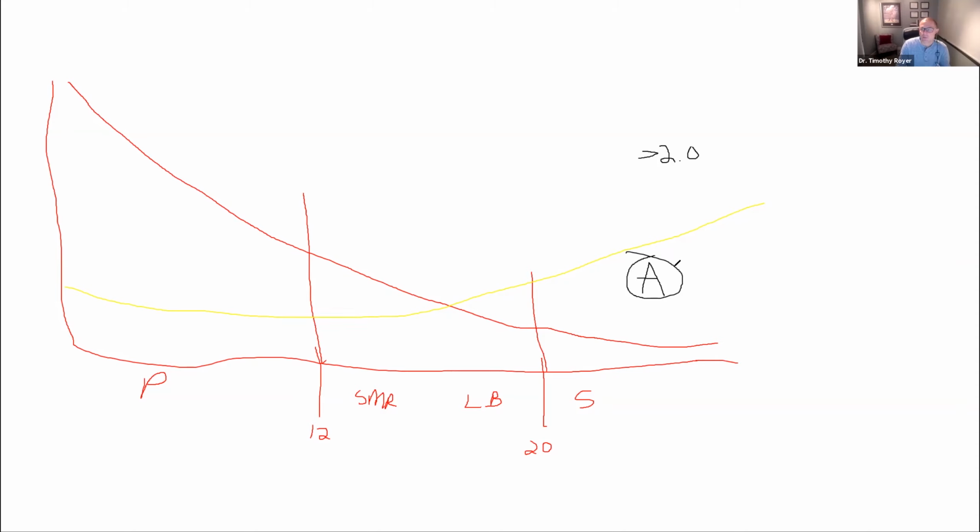Other things that could be a biomarker for when this gets greater than 2.0, things to think about. Let's type up a few here, okay? I want you to be thinking about when you see that high beta gets above 2.0, we definitely want to think about just general anxiety, okay? But we also might be thinking about OCD, could be thinking about some PTSD. The higher this gets, if we get up in the 3s, okay? Physiologically, you might be thinking about maybe is there migraine. You might be thinking about chronic pain.